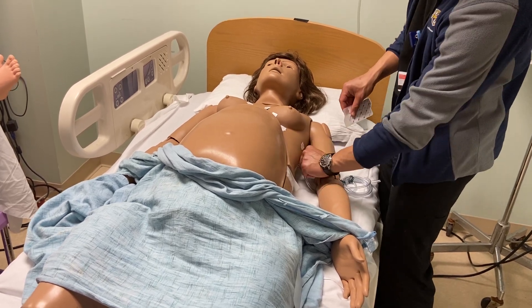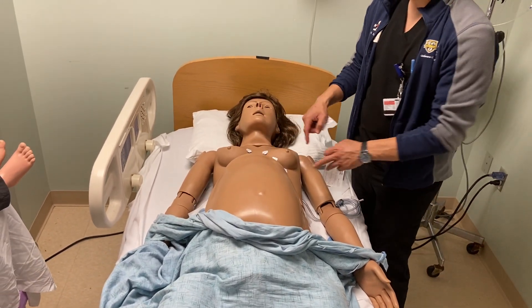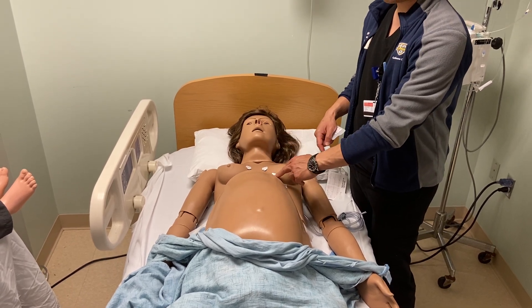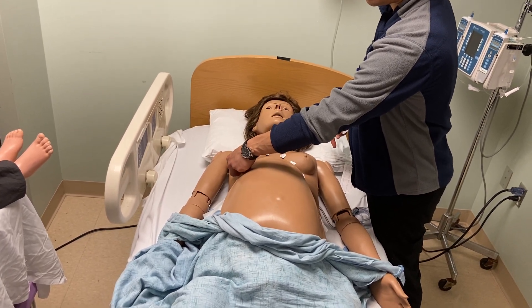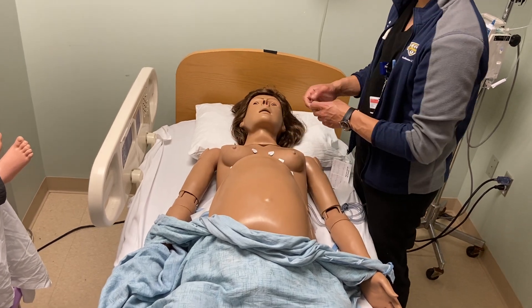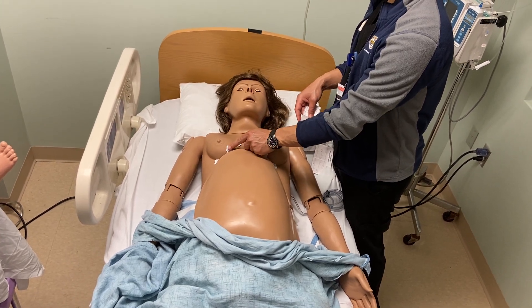V7 will be just past that. Moving over to the right side, our leads will just mirror, so we'll place V3R, which will mirror V3, and V4R, which will mirror V4 right in the inframammary crease in the fifth intercostal space in the mid-clavicular line. V3R will be right in between V1 and V4R.